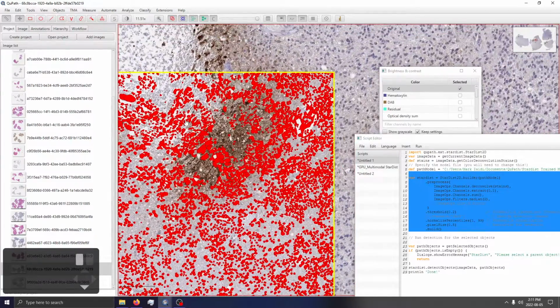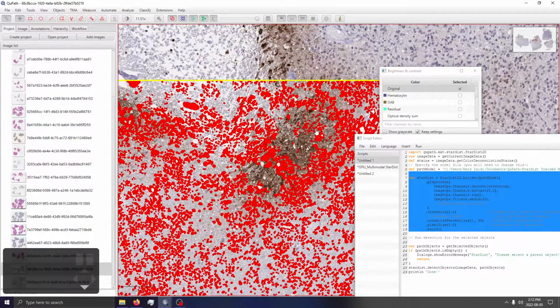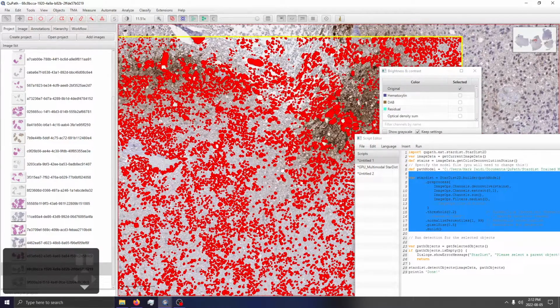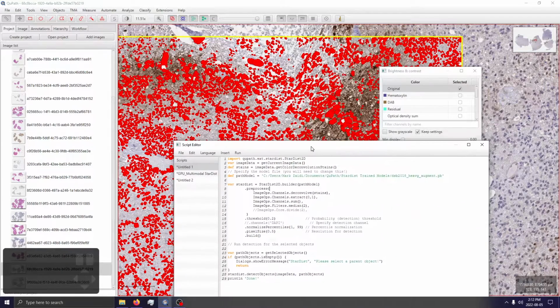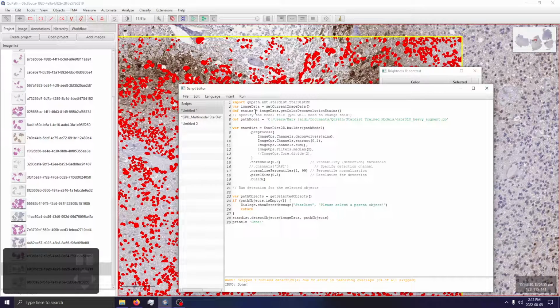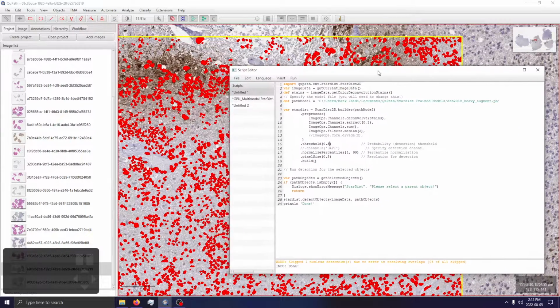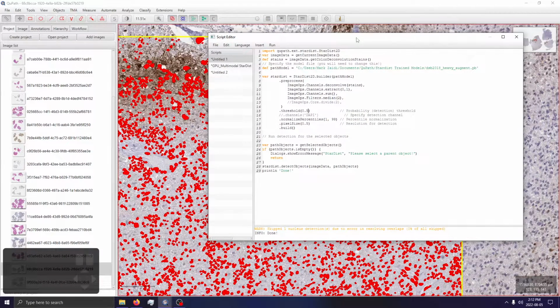Nonetheless, I hope this video was still informative to people of all QuPath experiences. If you have any questions, comments, or concerns, feel free to let me know. But other than that, I hope this serves as a reasonable framework for understanding how one could go about detecting nuclei with really intense DAB or hematoxylin staining using StarDist. Of course, the better solution would be to train a model by yourself, but even to this day, I haven't done it. And it requires a lot of time and effort and, well, computational resources.